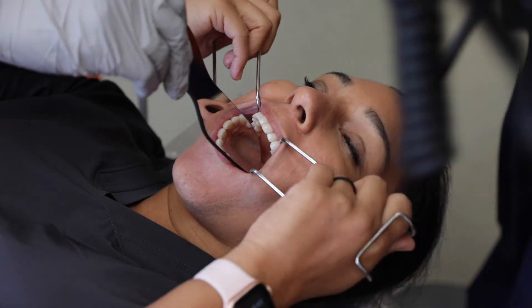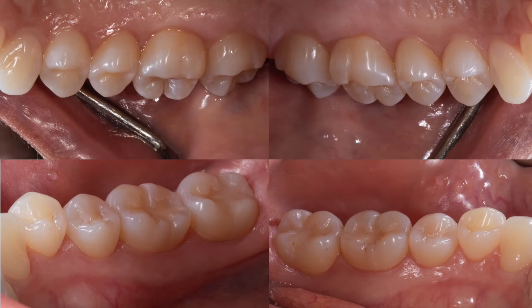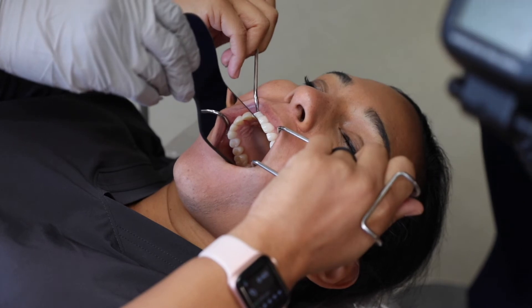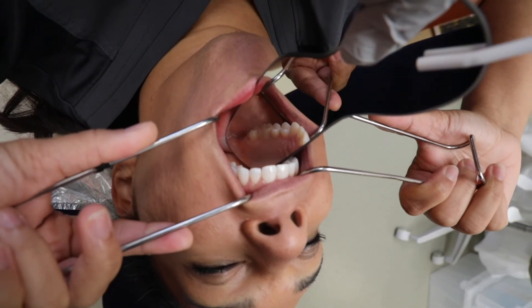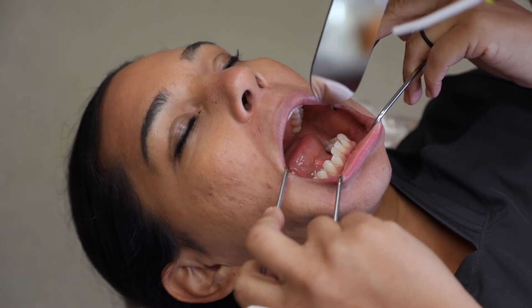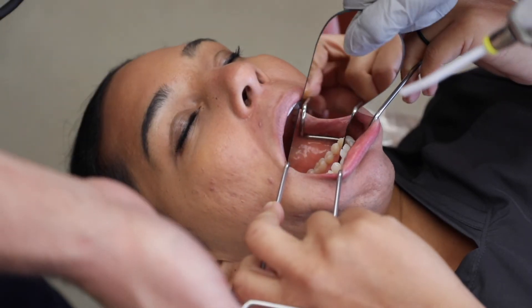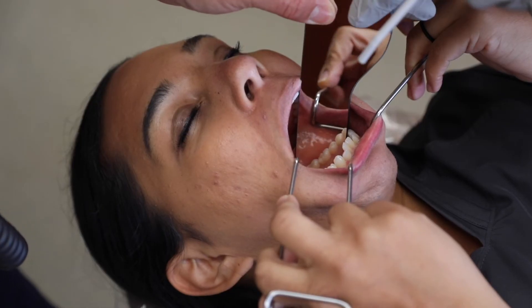The retracted lingual views represent four total images, one for each quadrant. The occlusal plane of the quadrant should parallel the upper and lower border of the image. At a minimum, try to capture from the distal of the canine to the most posterior tooth in the quadrant. Focus on the first or second premolar. For the upper linguals, have the patient retract out, forward, and upward — the assistant places the mirror closer to the midline of the palate and angles it away from the teeth toward the camera. For the lower linguals, the patient retracts out, forward, and downward. The assistant places the mirror between the teeth and the tongue, retracting toward the midline, away from the teeth, and toward the camera.